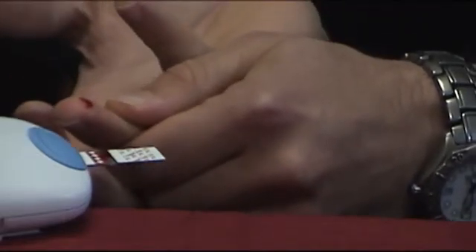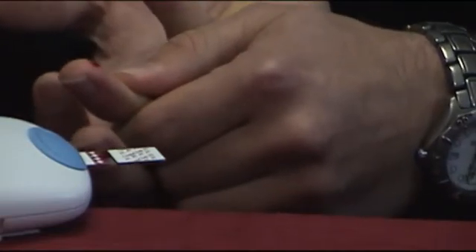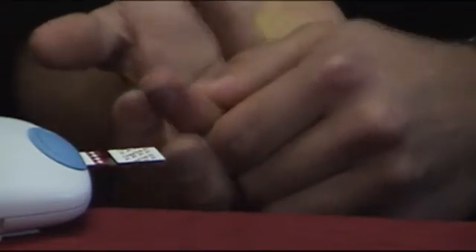Continue holding your finger there until you hear the meter beep. Once the meter beeps, the countdown numbers will disappear and the meter will begin running its test. Your result will appear and you will now have your INR test result.